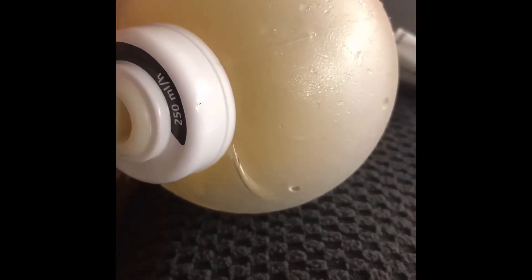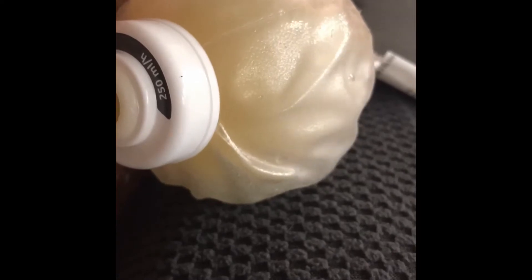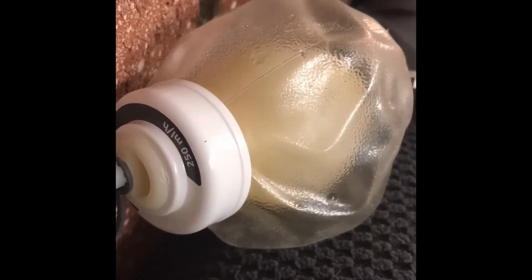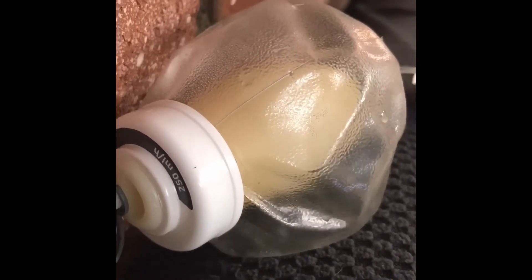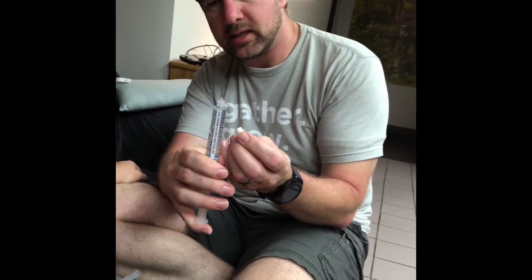Now we are finishing up and disconnecting the vancomycin. I'm going to flush her. This is the second S in SASH — more saline. I'm making sure all the air bubbles are out, then I push it up with the cap on to pop the seal, and squeeze so that there's no air in there.